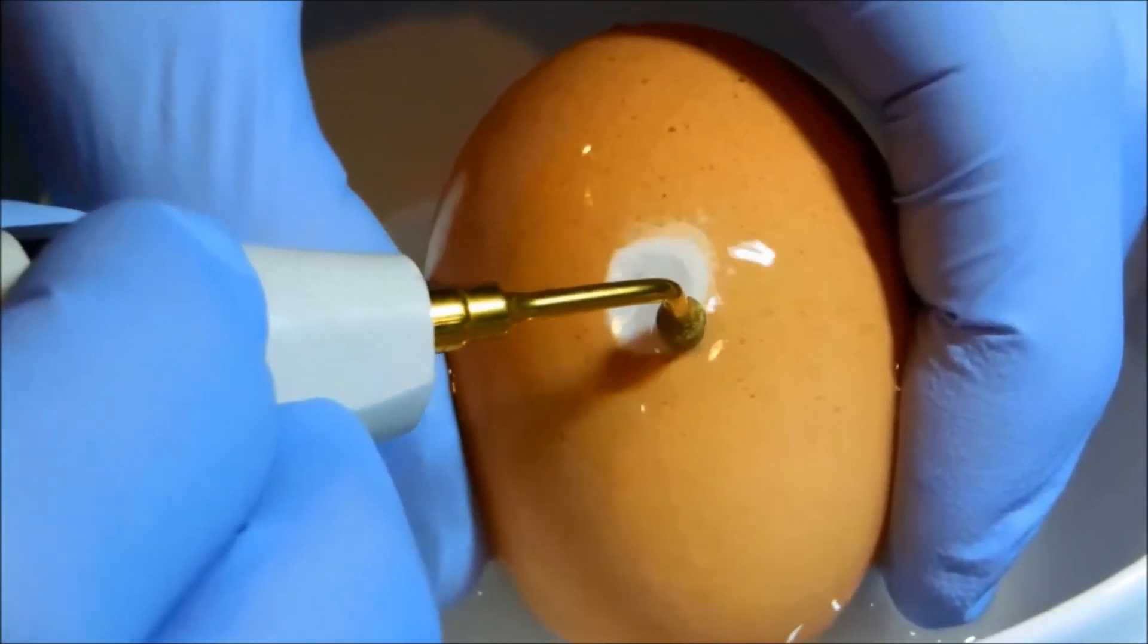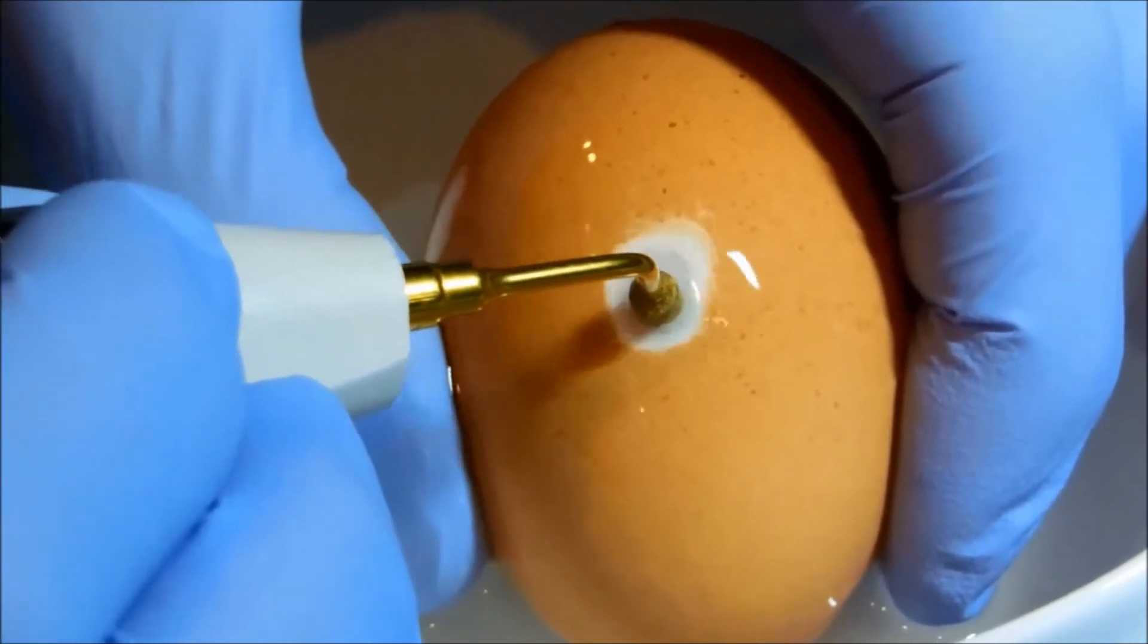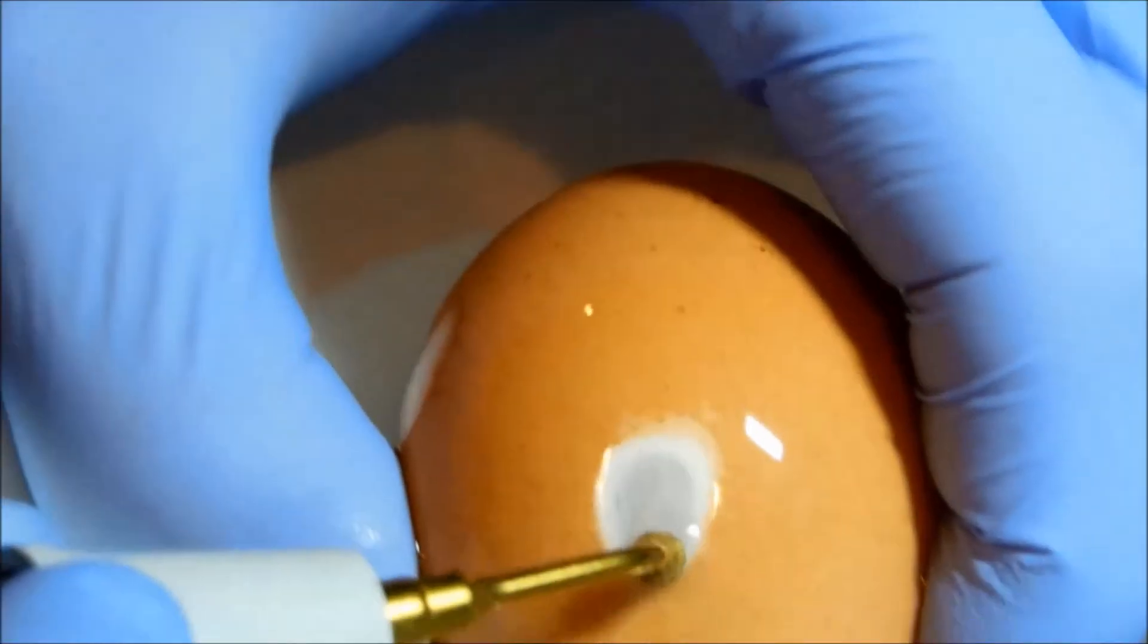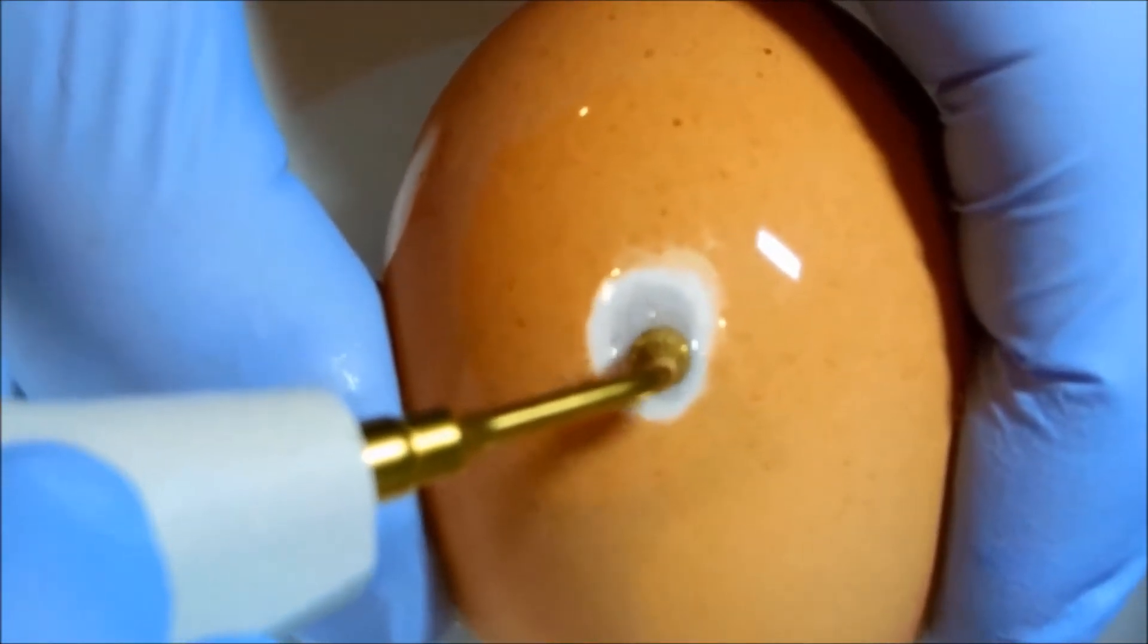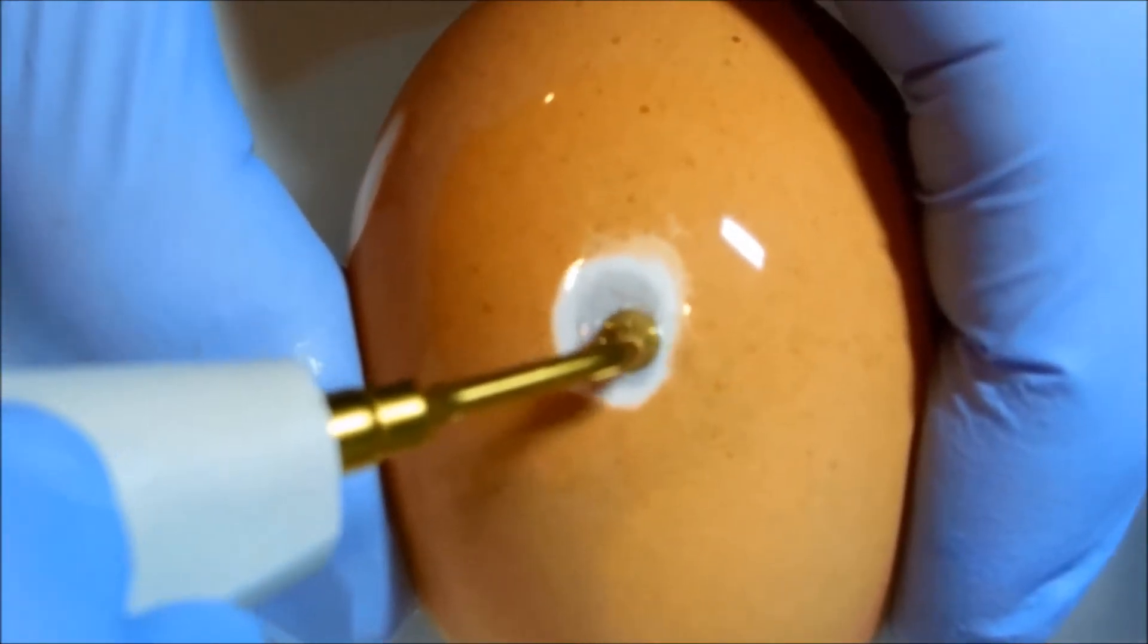I'm starting to push slowly to really fall under. Here we are. And this is showing us an intact membrane.